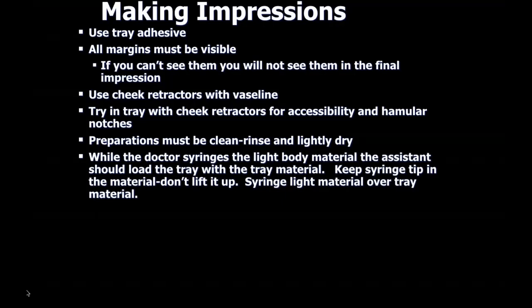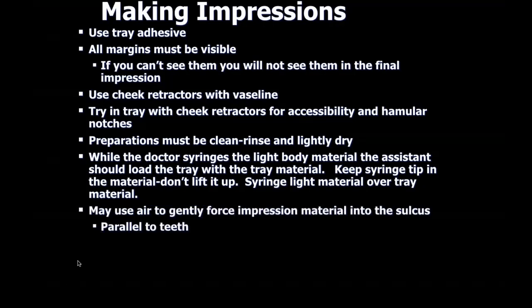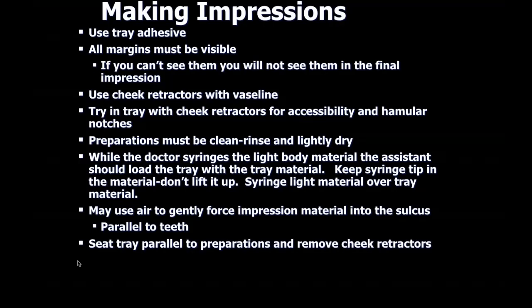What happens is my assistant, when I go through, and if I have multiple units, I will put a light body down. I'll give a little air on it to go back with another light body. The second time I go back, she is filling the tray. My assistant is filling the tray. And then there it talks about how I use a little air to blow into the impression. And that's very helpful, especially if you have a deep, deep cervical impression.